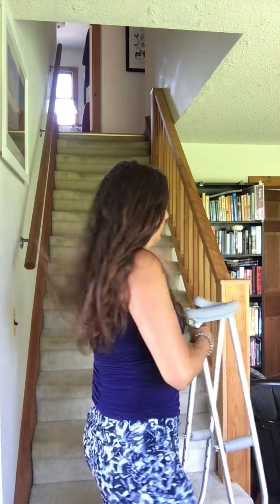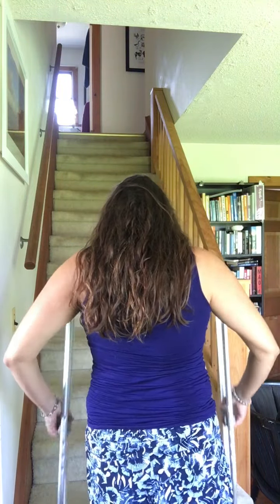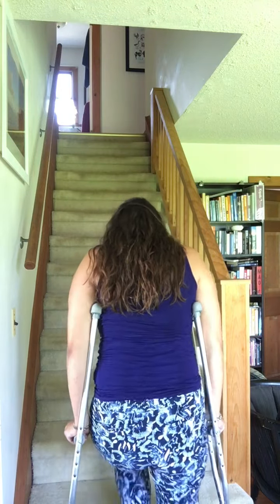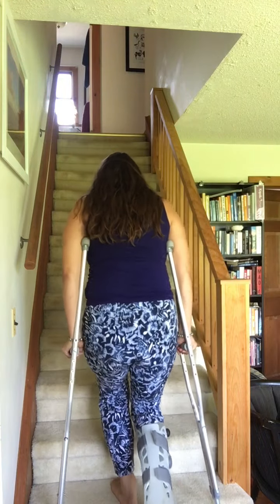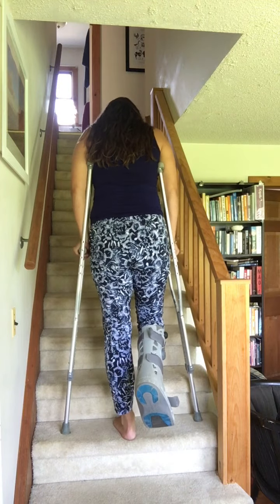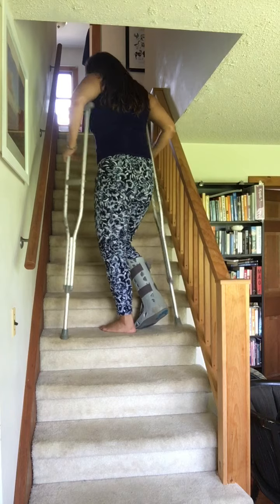When you're ready to try it properly, going up is easier than coming down. For going up, you start with the crutches on the same level as you — don't try to put them up first. You want your foot behind you like when we walk, pressing in, just lifting the foot up, bringing the crutches up to the level of the foot, and repeat. Crutches come up to the same level as the foot, then you bring the good foot up.